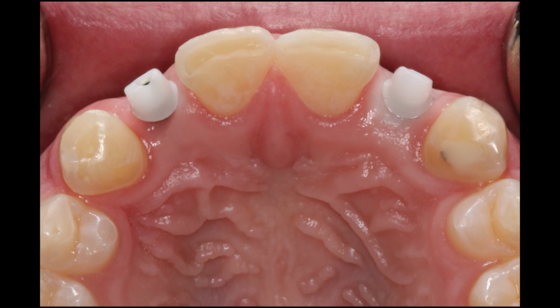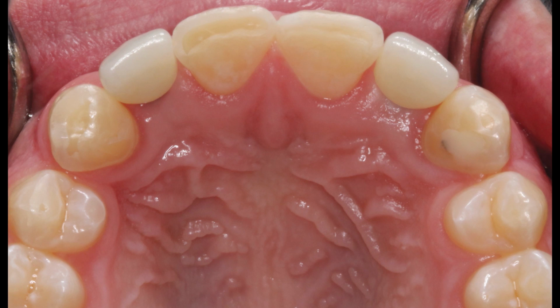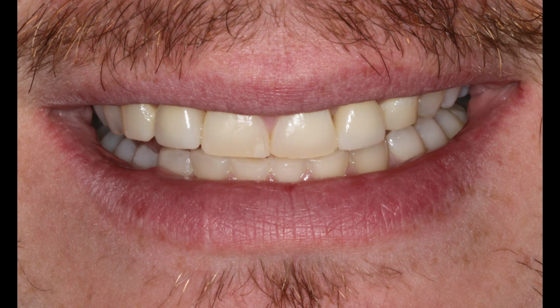The margins of the custom abutments were designed to be equigingival or just slightly subgingival, simplifying cement removal and eliminating the possibility of cement remnants creating periodontal issues. The BruxZir Anterior crowns were cemented over the custom abutments without difficulty. The final restorations created excellent function and aesthetic emergence profile.